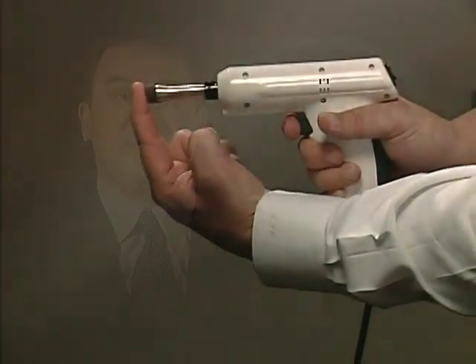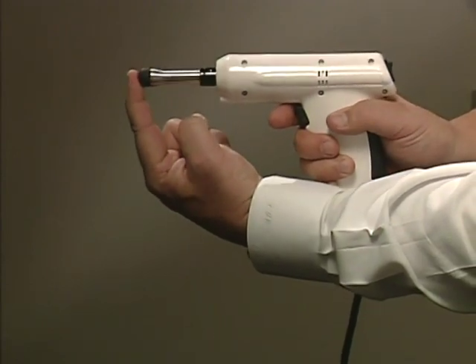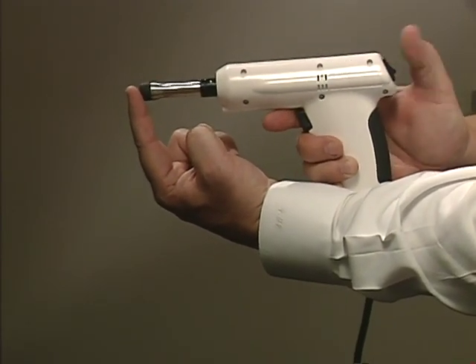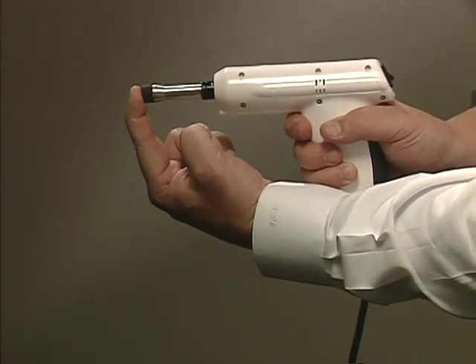Prior to applying the instrument to the patient, you should familiarize yourself with each of the instrument's 3 force settings. You can get a feel for the force settings by activating the device against your hand. Always ensure that you've selected the right force setting that you determine is clinically indicated.